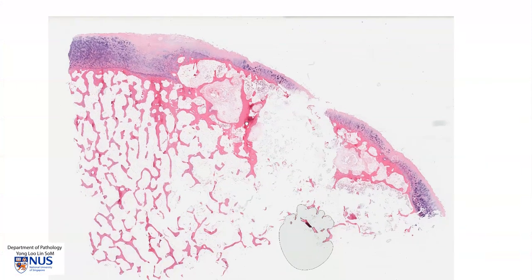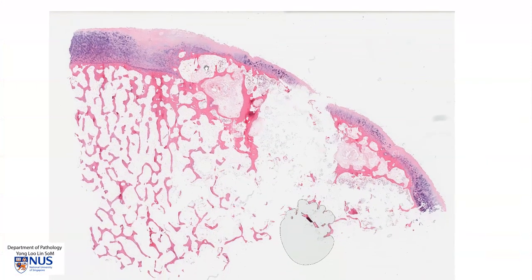In summary, this is an example of the head of the femur showing the articular surface with features of osteoarthritis. We have irregular thinning of the cartilage. We have fibrillation. We have focal proliferation of the chondrocytes. And we also have the formation of subchondral bone cysts.